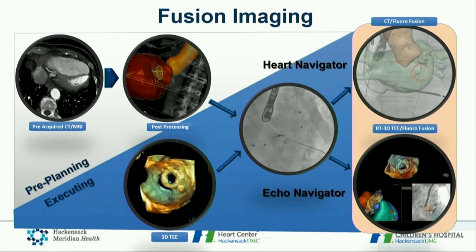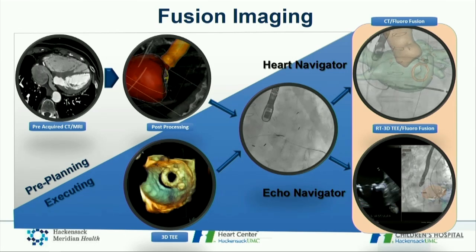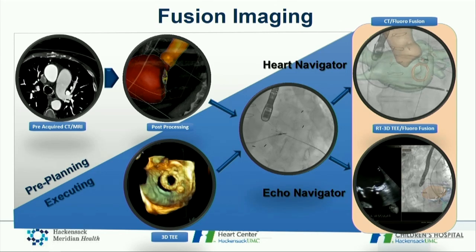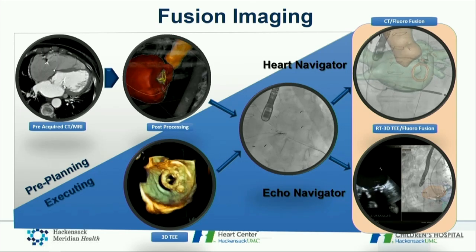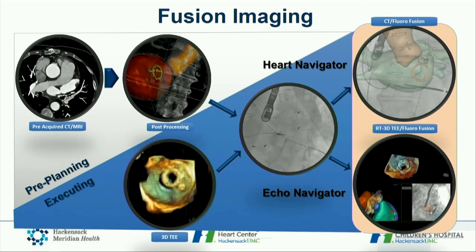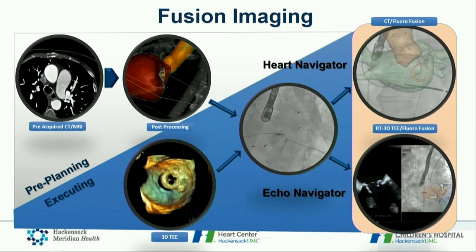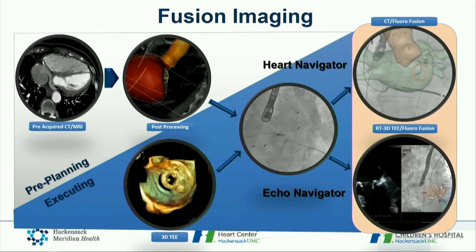As you know, there are numerous limitations for each modality. For example, fluoroscopy lacks three-dimensional depth, and there's increased use of radiation, contrast, and things like that. CT and MRI are not real-time. CT, as you know, has radiation risk. MRI has poor spatial resolution.